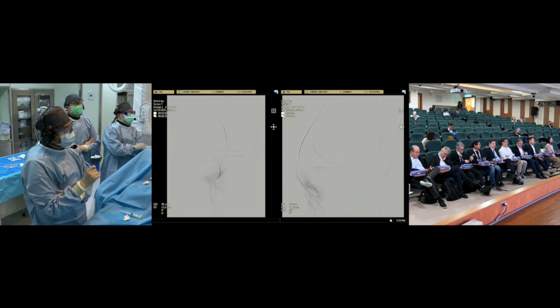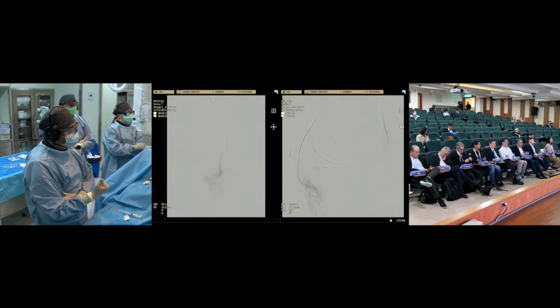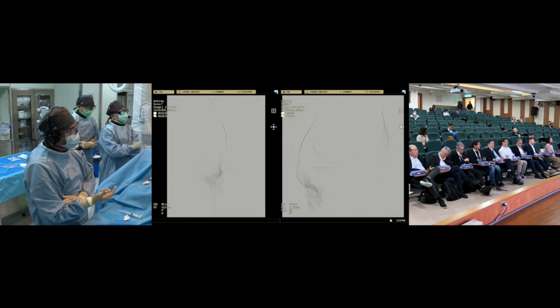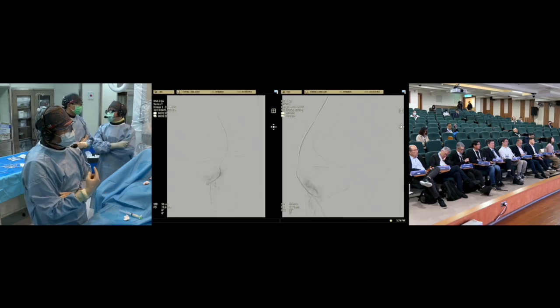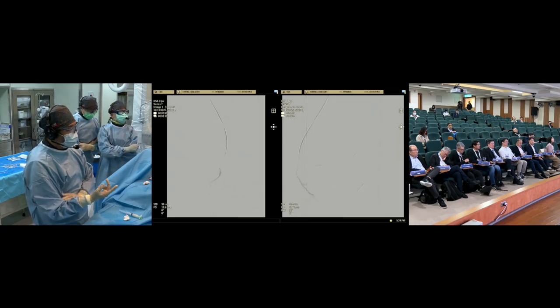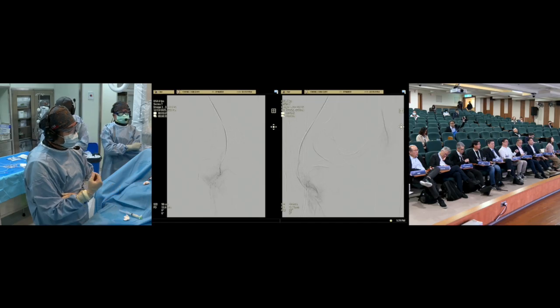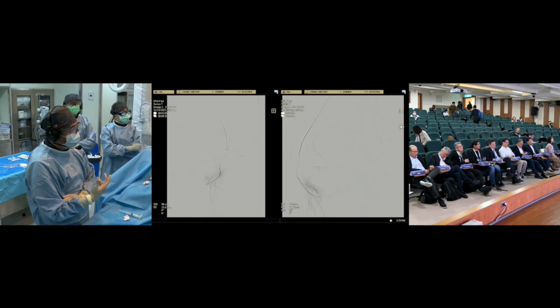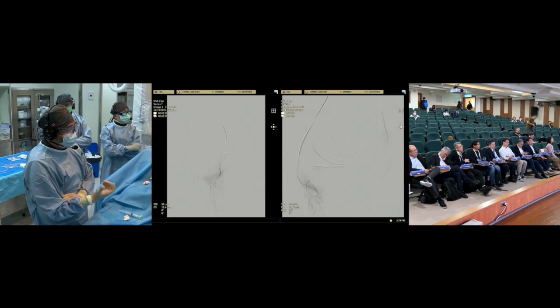When you survey all the genicular arteries, if the moya vessel is prominent and the evoked pain is prominent, and you ask the patient where she feels painful, you can give more emboli agent, like 1.5, even 2 cc. But if you engage, like for this patient, the lateral superior genicular artery, and ask her, and she says there is no painful feeling, you can only give 0.5 cc.